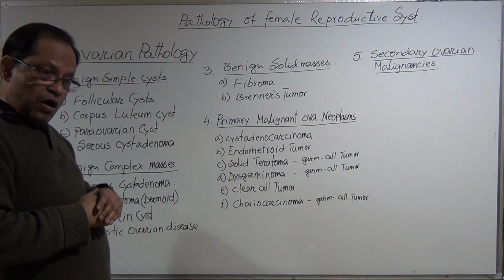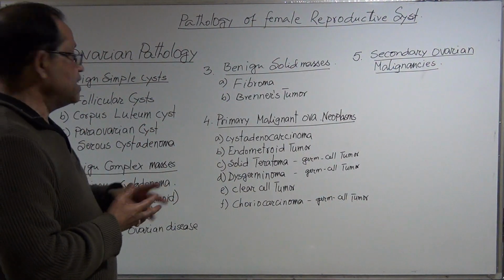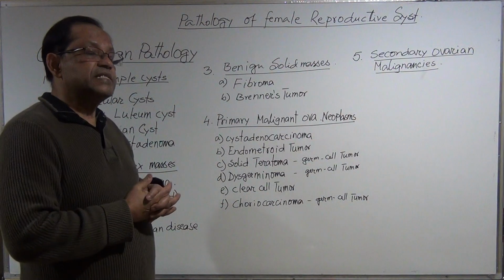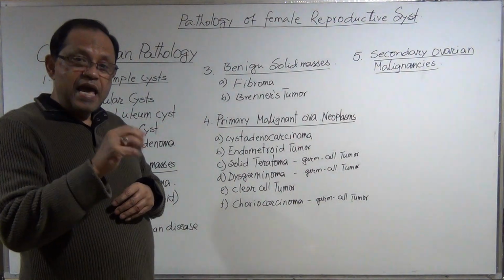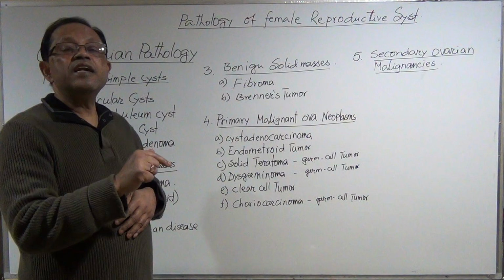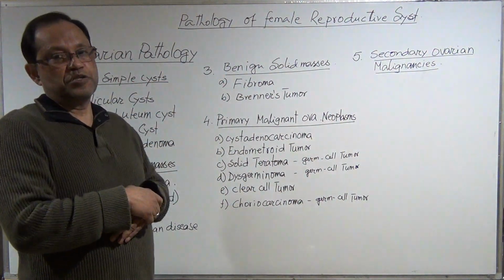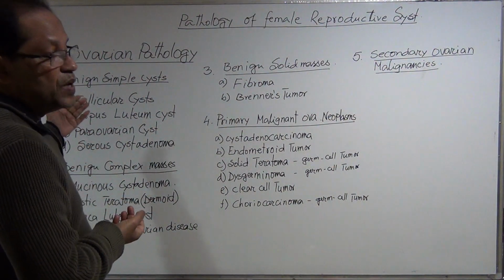Okay, so that's why, do I need to measure the corpus luteum? Yes. How? The same way as you measure the follicular cyst. What would be the characteristics of the corpus luteum? Most of the time, the wall will be thicker and the size of the corpus luteum would be bigger. There might be internal echo because of the blood and blood clot, and hypervascularity around the corpus luteum. Okay, so this is corpus luteum.